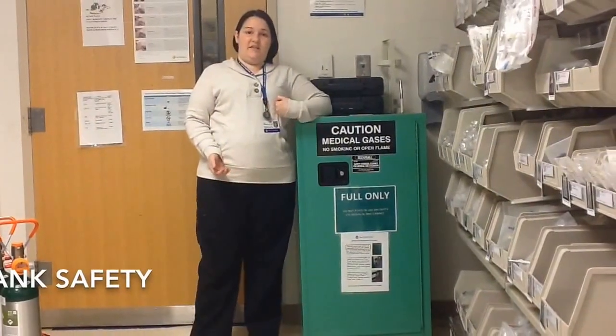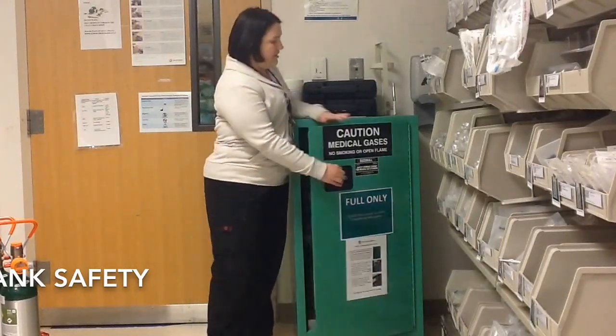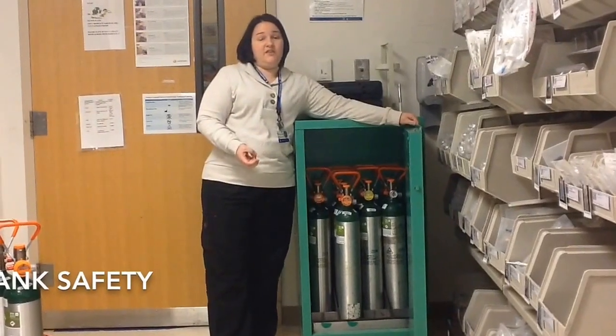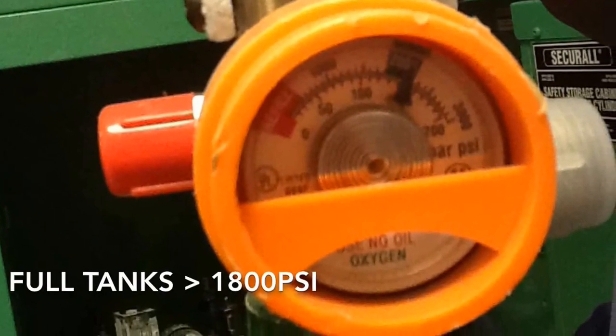Now I want to talk about tank safety. If you're needing to transport a patient with oxygen, your first place you want to go is the tank bin here. Every tank in here is 100% full. A full tank has 1800 psi. So grab your tank, make sure that the dial is in the green, that's 1800 psi.